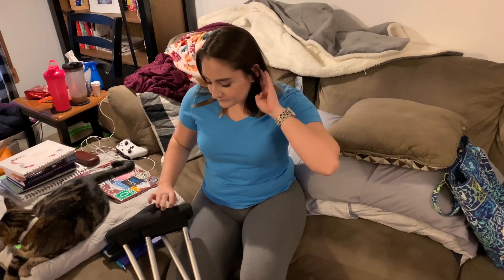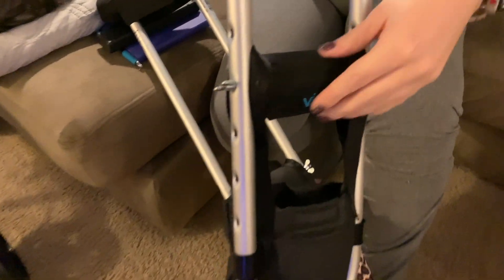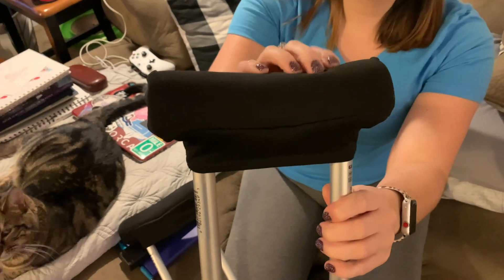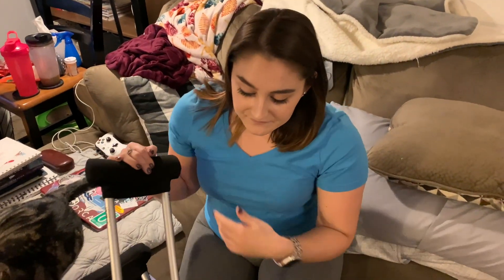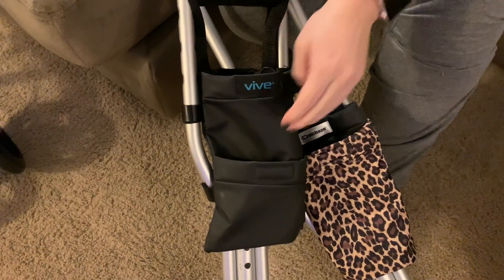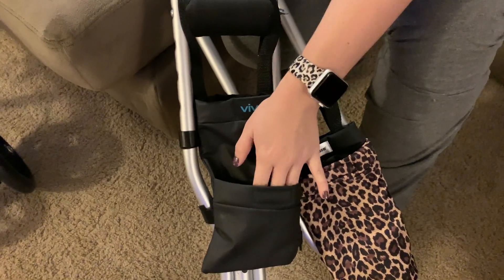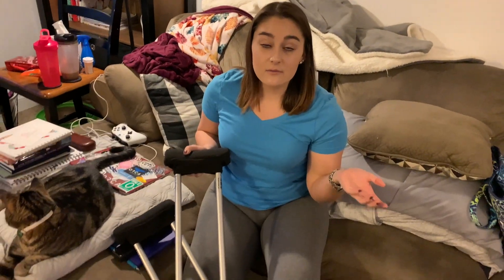These hand pads and this armpit pad are both by Vive and they were like twelve or thirteen dollars on Amazon. They are very padded which makes such a big difference. This little guy is also by Vive — this was the first one I got. It's really nice for my phone and I actually have enough room to put my phone backwards in here and have my flashlight facing out at night if I need to go use the bathroom so I can see and don't trip over anything with my crutches.